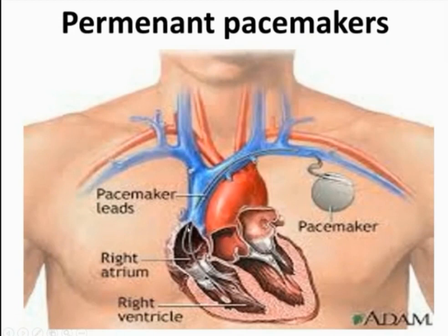It is important to pace both the atrium and the ventricle at the same time because مثل ما قلنا احنا، اذا if we just pace the ventricle, the atrium will not function well, because you are pacing the ventricle regardless of the timing with the atrium. So we want to synchronize the atrium and we don't want to throw out the cardiac output coming from the right atrium because it's important. So we have to synchronize the atrial contraction with the ventricle contraction in order to simulate a normal heartbeat.